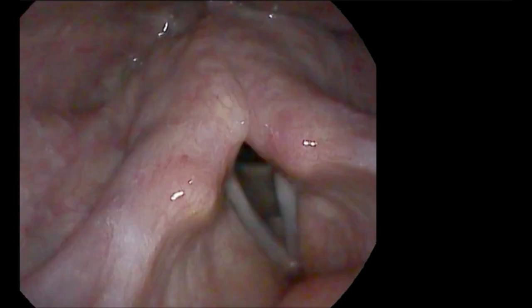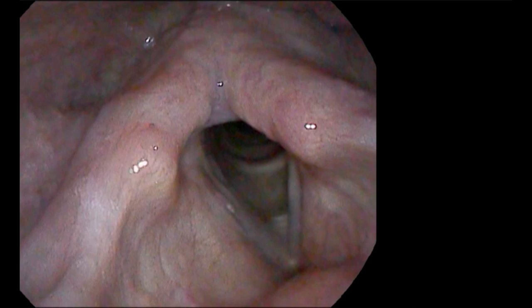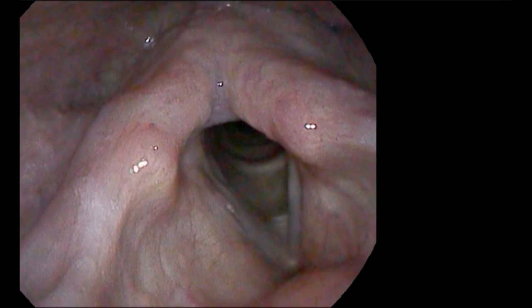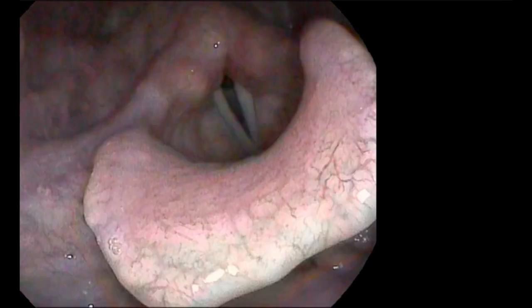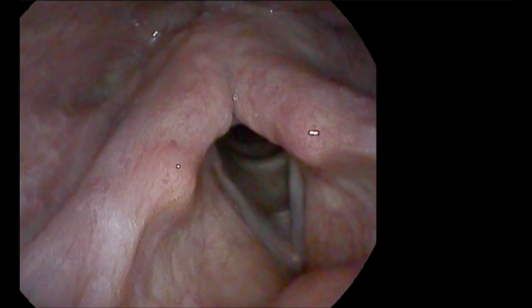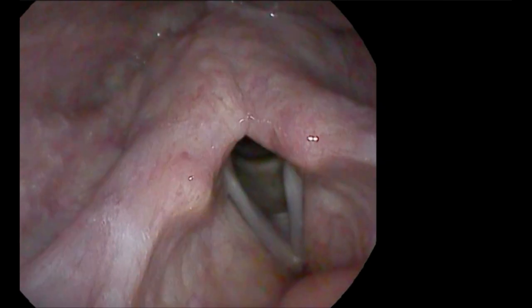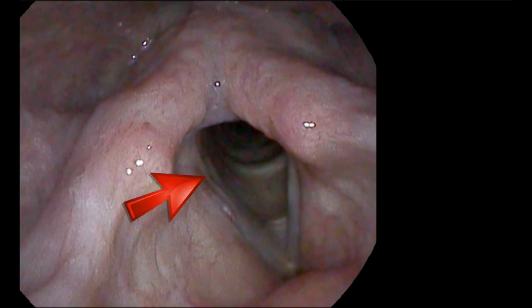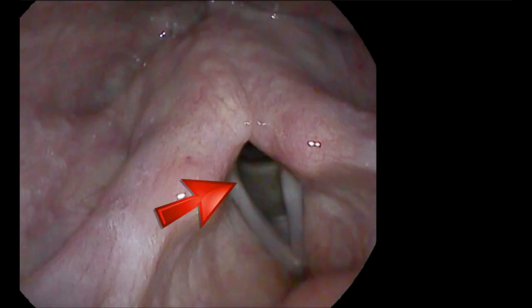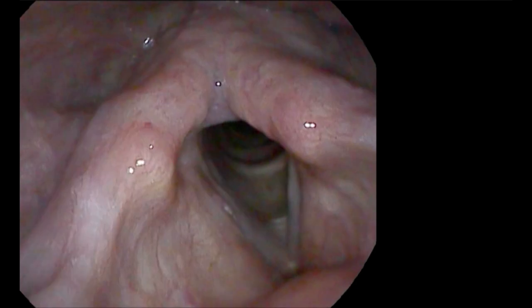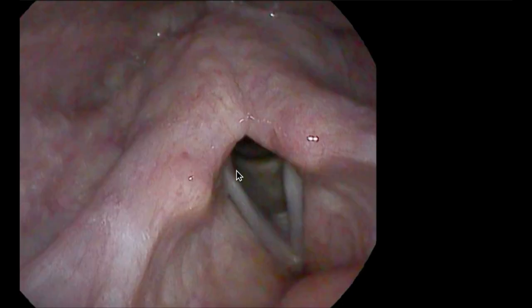During breathing, we can focus in on the vocal process. Here is the right vocal process; the left is here. Let's watch the right here during expiration. The right vocal process only moves in from here to here. And even when it moves in, we can see that it maintains a very obtuse angle — there has been no rotation of the vocal process medially.